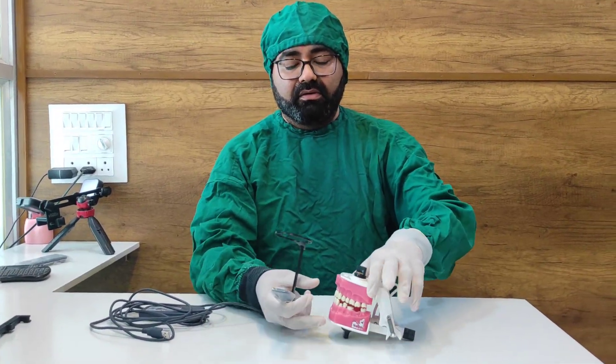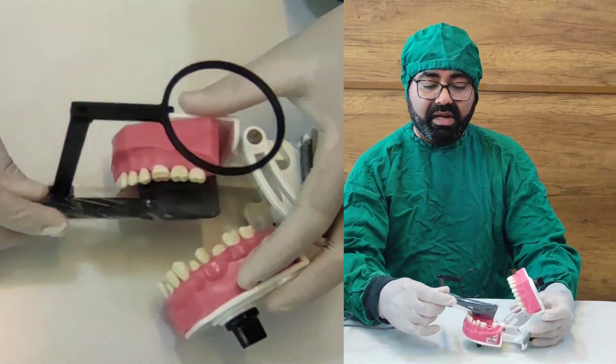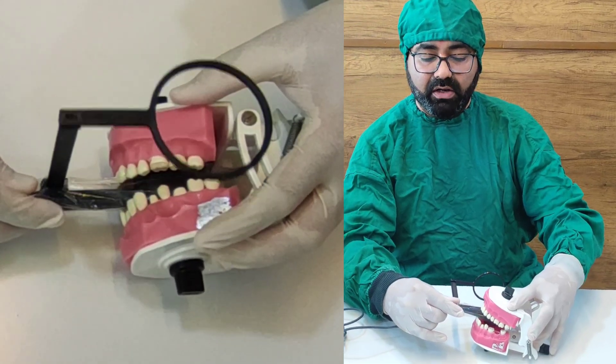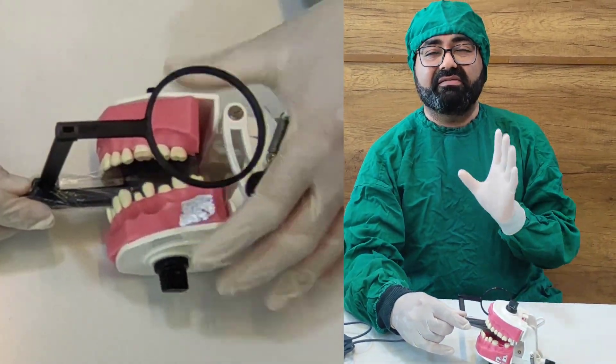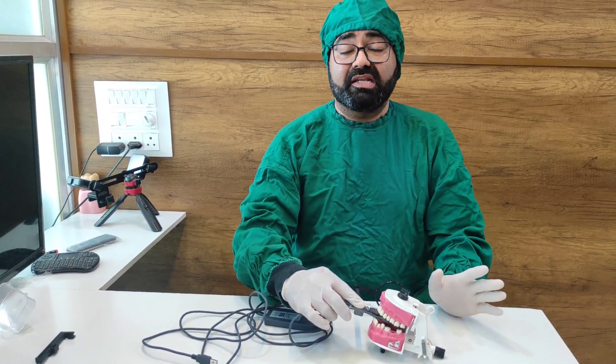Here we have got our patient ready. I am placing it on this side and here is our positioner. I want to take an X-ray of the 4th quadrant, so I am going to carry this and place it in the patient's mouth, and the patient can then gently close over it. This makes it very comfortable. When you hold it with your hand, the circumference of your hand is bigger and the patient has to keep their mouth wide open. When the patient keeps the mouth wider open, the floor of the mouth pushes up, making it difficult to take an X-ray. With the X-ray holder, you can place it in the patient's mouth and ask the patient to close gently — the floor of the mouth goes down and it is comfortable for the patient.